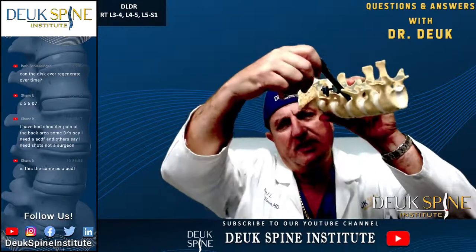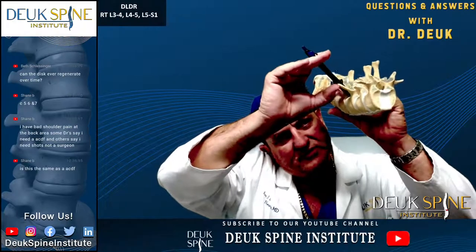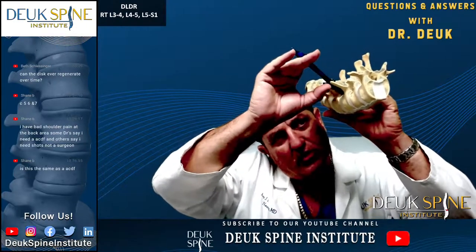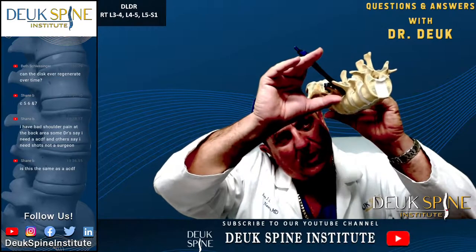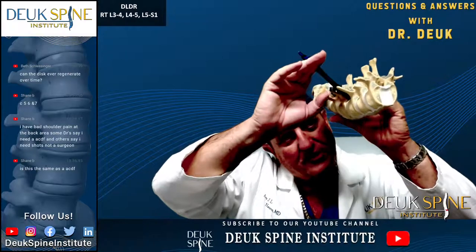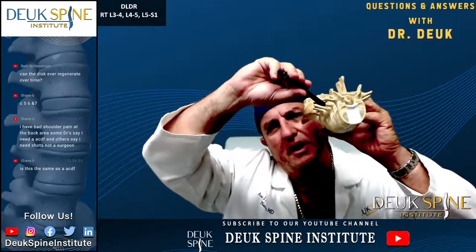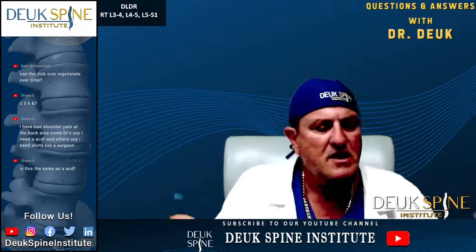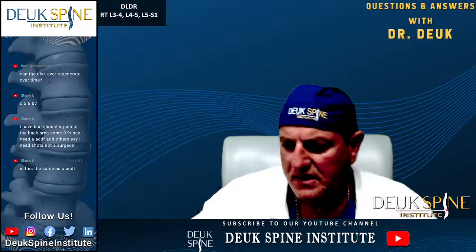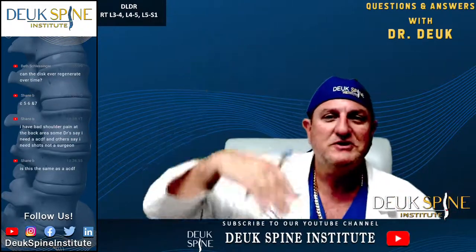Now, look carefully here. You see how there are these things called the transverse processes right here? Okay, I hope you can see those. All the organs that are vital are below this level of the transverse processes down here. So as long as you stay above, which we do, you're not going to puncture any organs because there are no organs back here. It's just muscle. So great question. I'm glad you asked it. But the answer is there are no organs as long as you do it right.